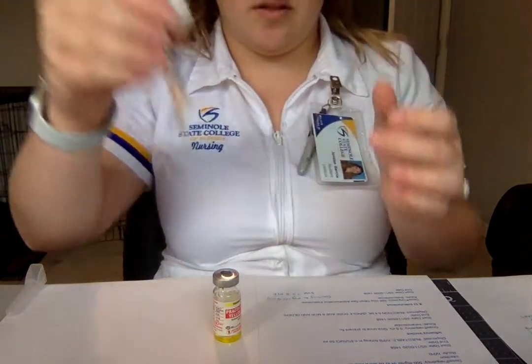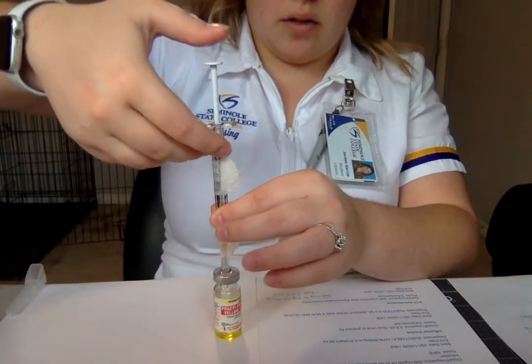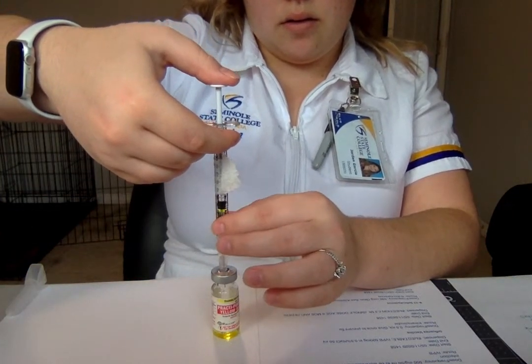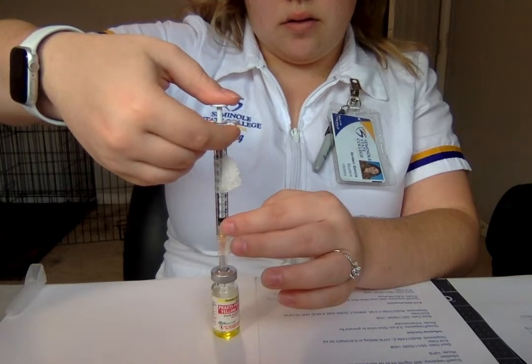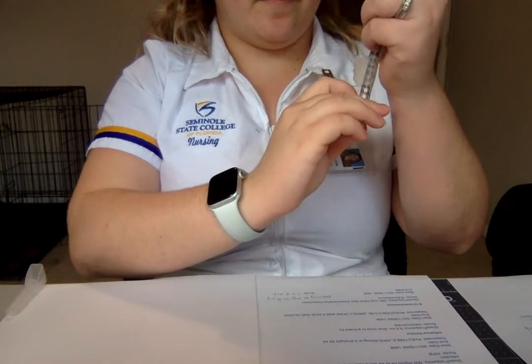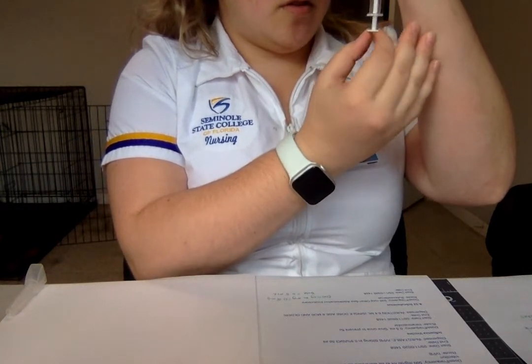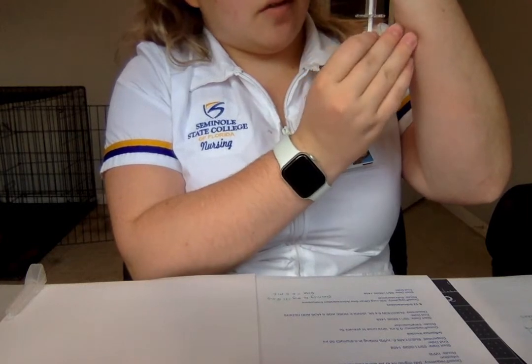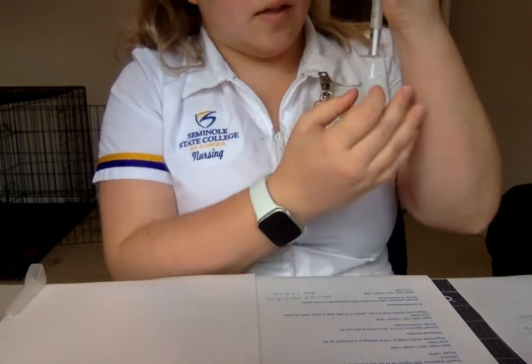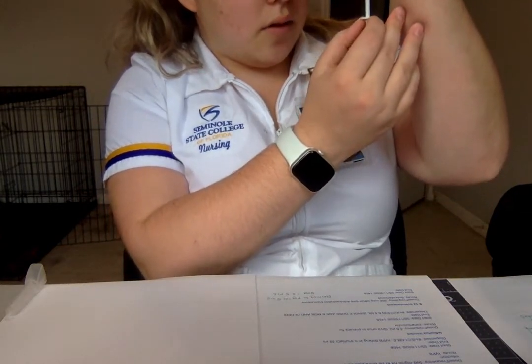Okay, perfect. And then I'm going to inject air to air. Again, not touching the plunger because I don't want to contaminate. Okay, and I'm going to flip. Again, pull back 0.5 mLs without touching the plunger because I don't want to contaminate. And again, if I get any air bubbles, I'll just flick them out. And I'm doing this at eye level so that I can make sure I'm getting it accurate.